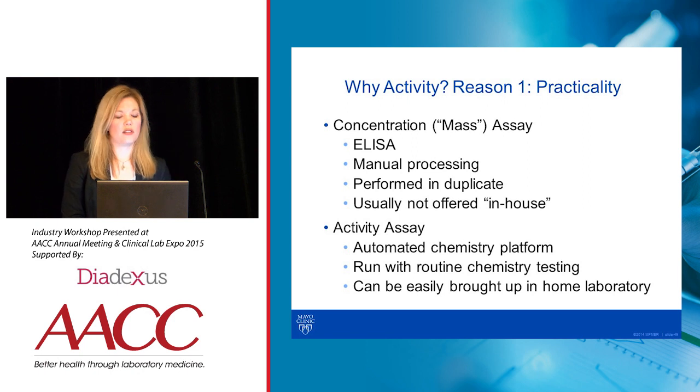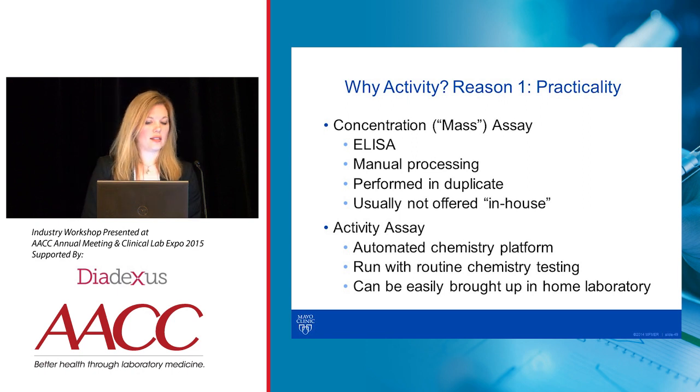Practicality is pretty straightforward. We have the two assays. We have the concentration assay, which is that ELISA assay. It's certainly a very manual process.